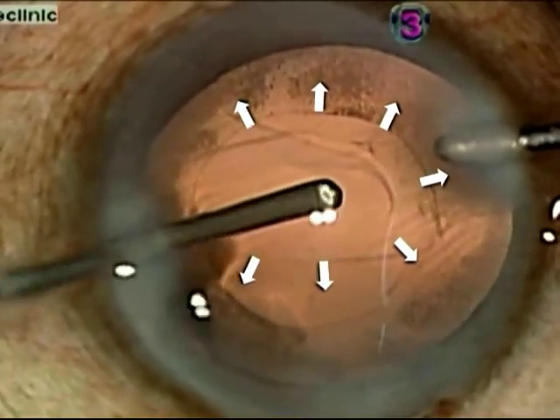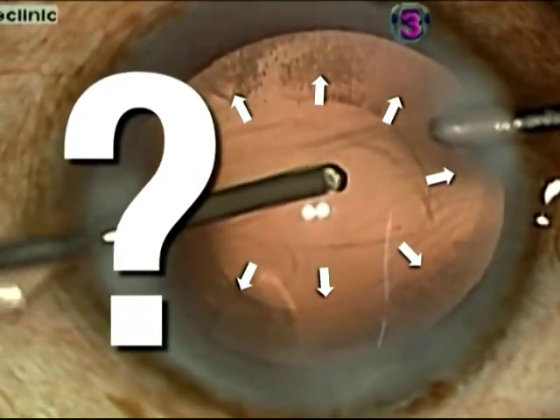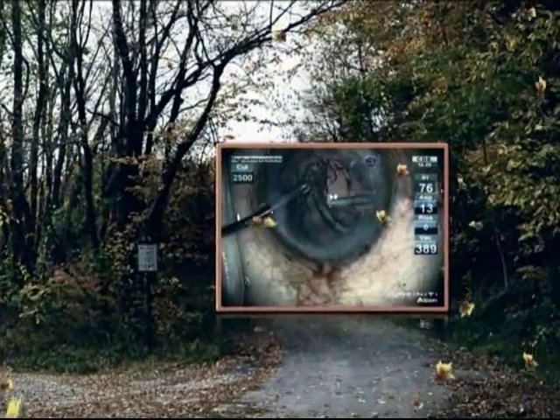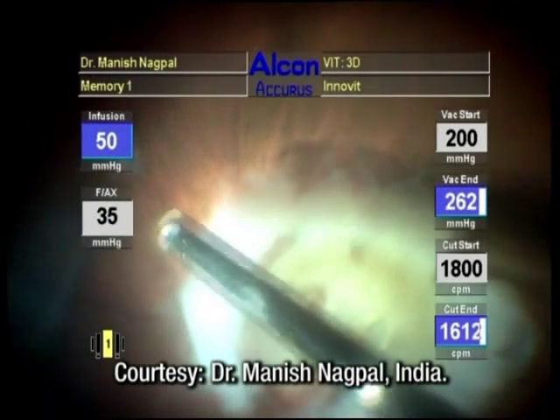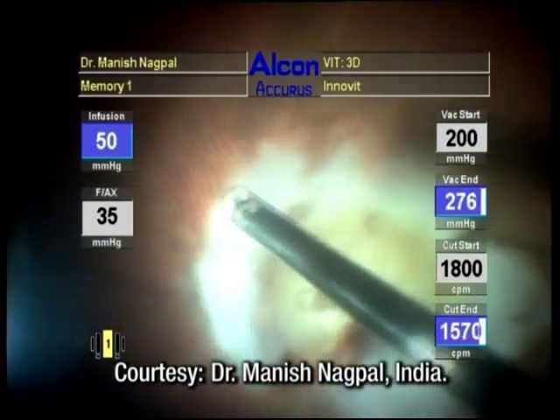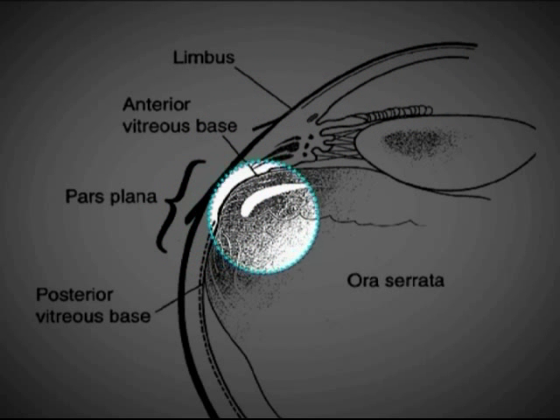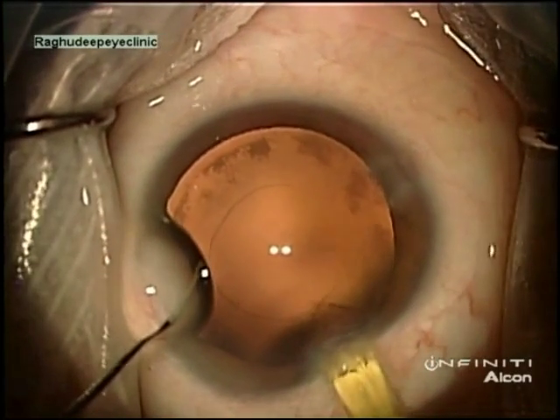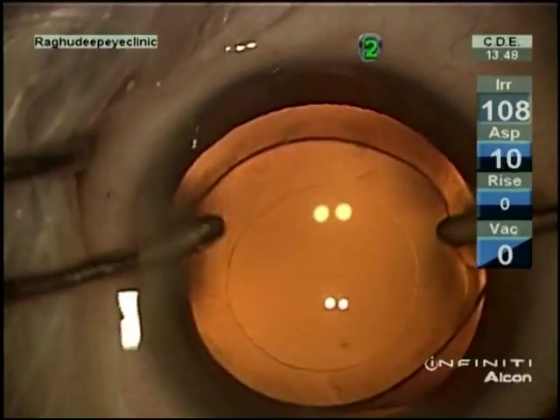But the real question is, is there any other way we could have ensured an adequate vitrectomy without compromising the original tear? Yes, there is another way. This road takes us to the vitreous through the pars plana. As we all know, the vitreoretinal surgeons always use this approach. But for most of us, the cataract surgeons, this is unfamiliar territory and hence intimidating. But for all of us, in-the-bag fixation of an IOL is the baseline goal of a successful cataract surgery.